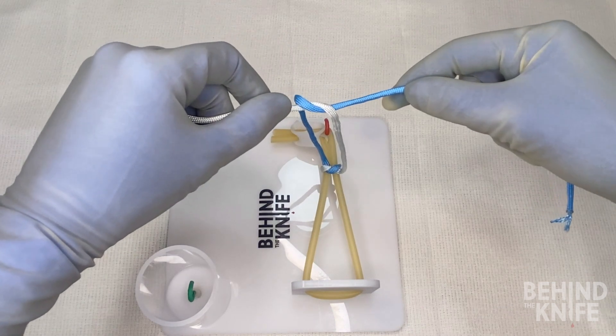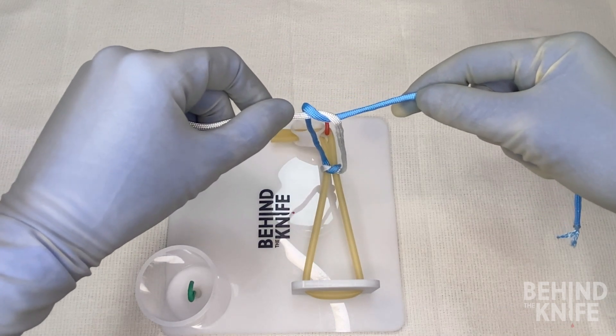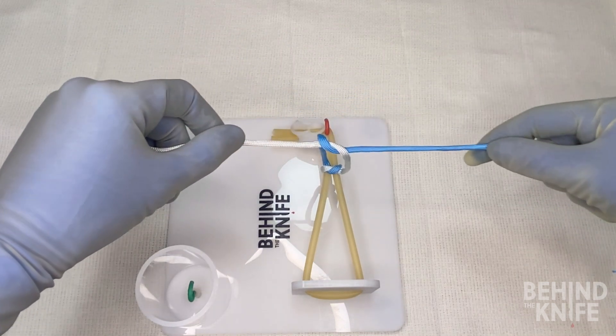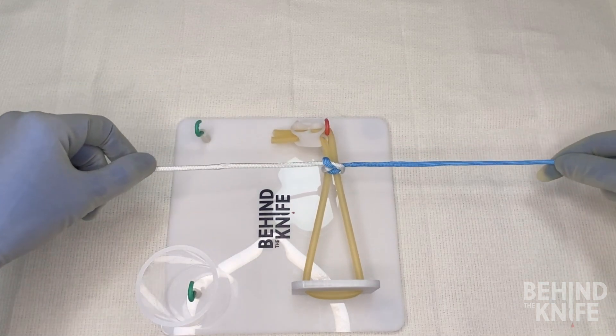Now, since we crossed our hands last time, we don't need to cross our hands this time in order to continue throwing down a nice square knot.